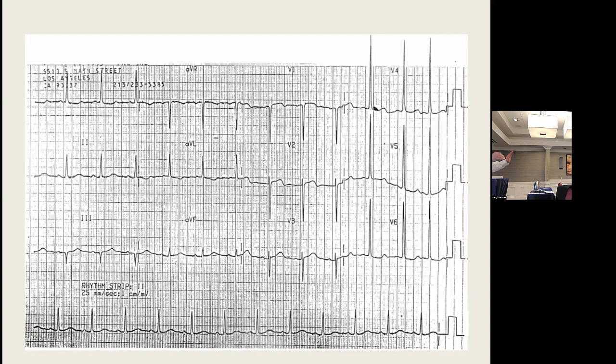So it behooves us to be able to identify on an EKG, because we are doing EKGs in patients with hypertension, do they or do they not have LVH? Okay, so I made that point. Now here's the rub. There's no perfect criteria for LVH. There are like 30 different criteria for LVH. And if you're an internist, they used to teach the Estes criteria, where you were measuring a point system and adding up points. And the more points you had, the more LVH you had. Well, and then there's the Cornell criteria, the Scheidt criteria.